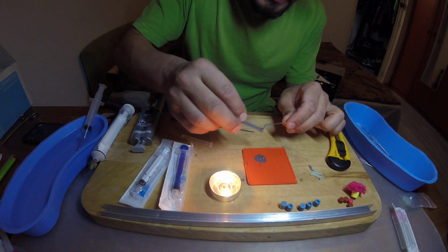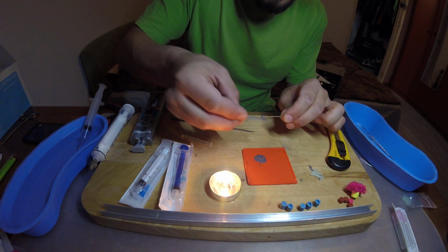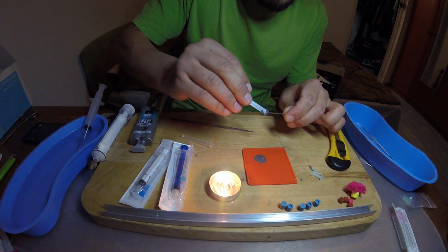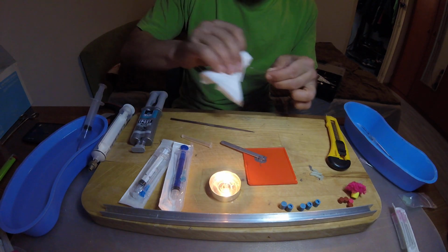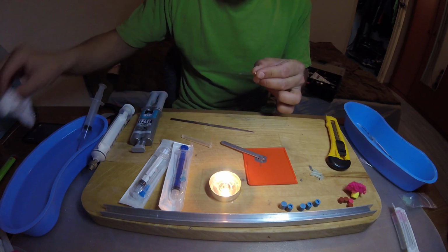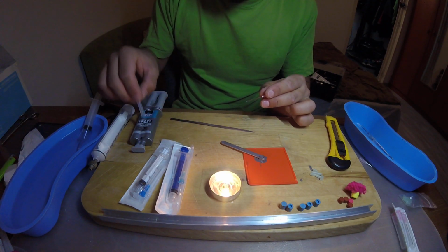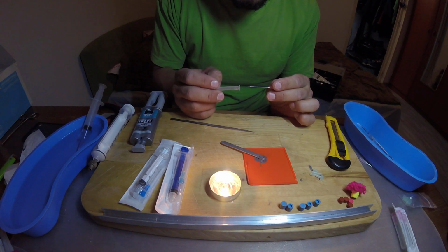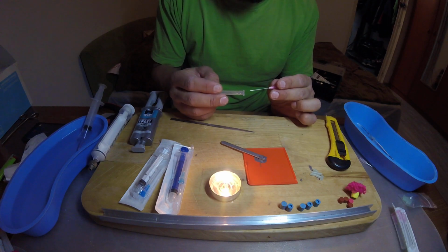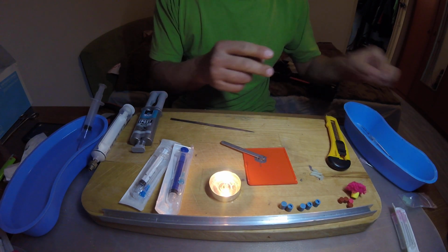Just put it inside here a bit and then clean it off like this, and this will be the needle. You wait for the epoxy to get dry and stick to the interior of the needle, and then after 12 hours this is good to go. So I'll leave it.